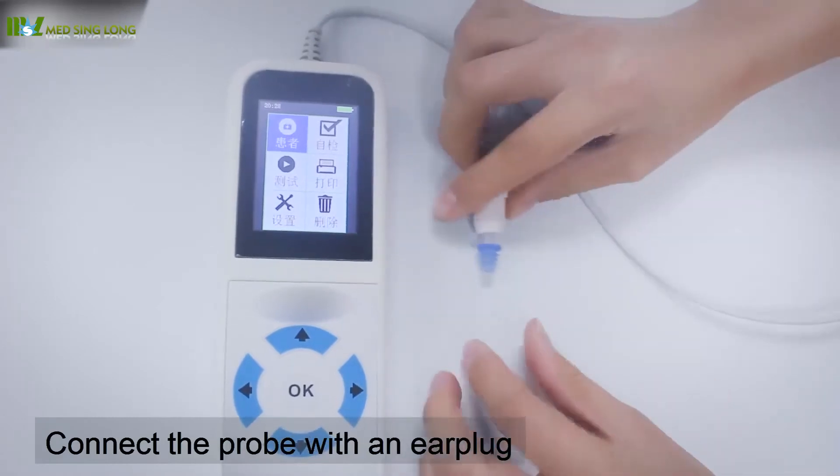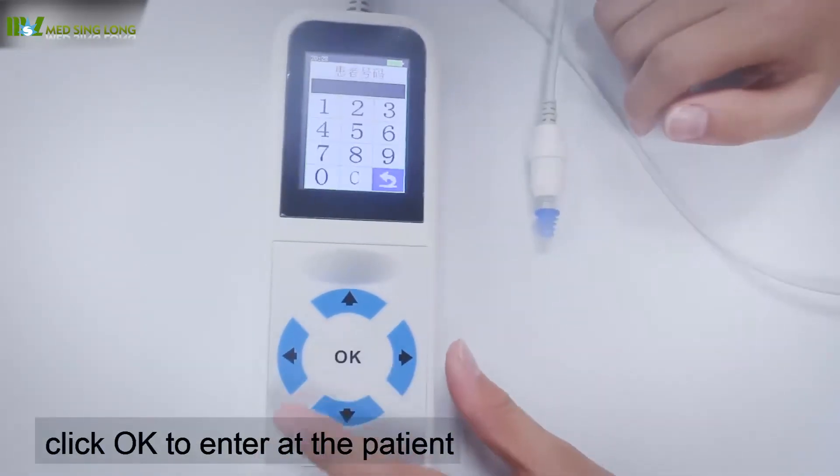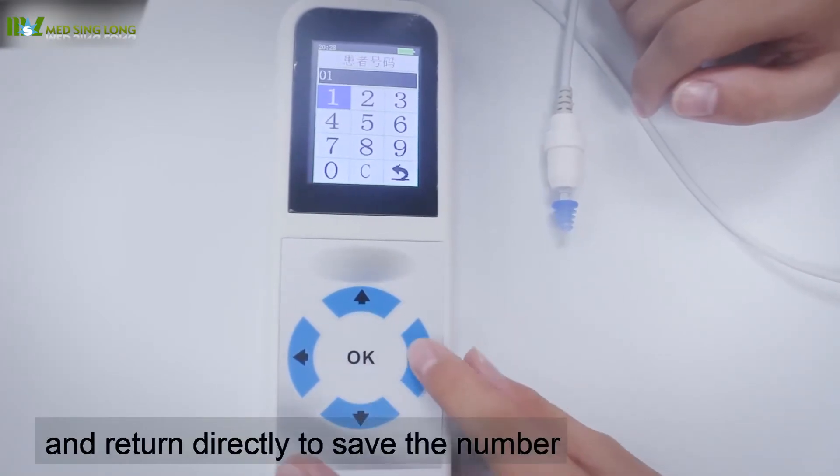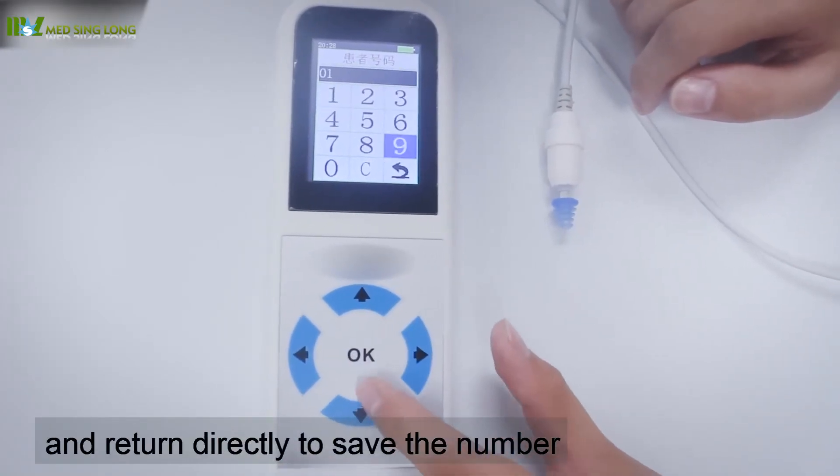Connect an ear plug that matches the patient. Click OK to enter patient information. Input the number and return directly to save the number.